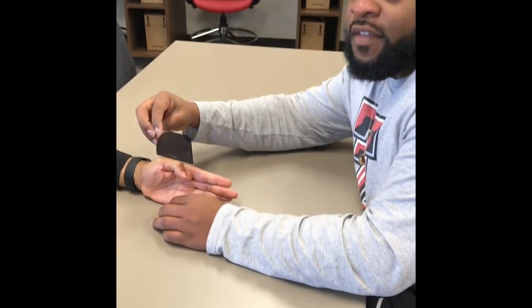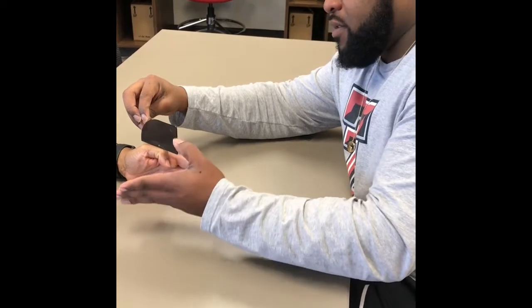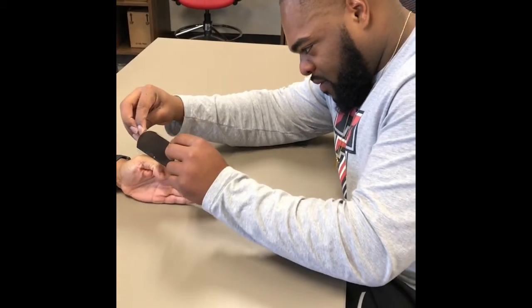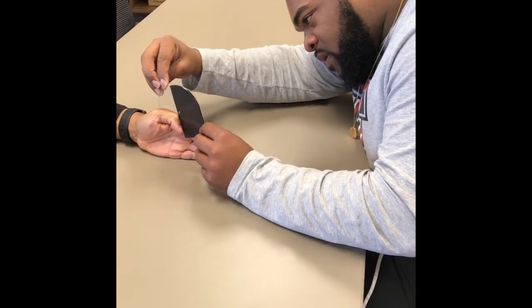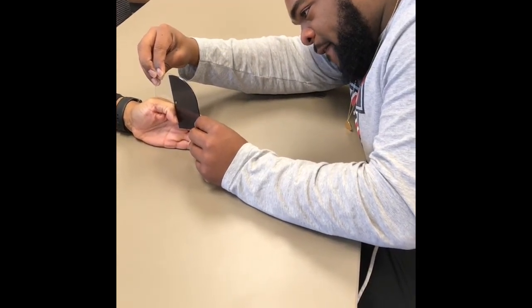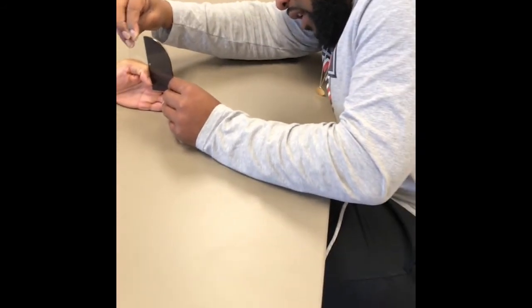And this one, we're going to be doing the flexion of the IP joint of the thumb and the normal range for this is 0 to 90 degrees. And this one is at 84.